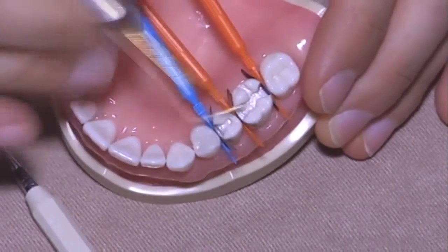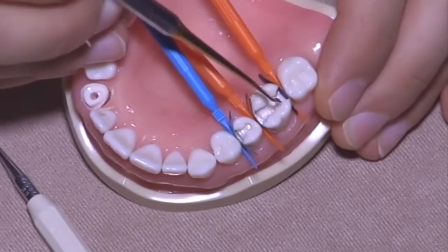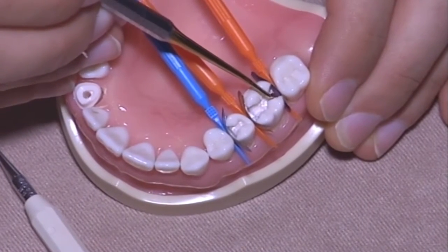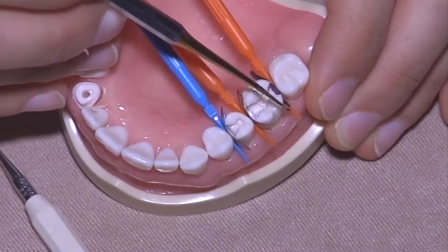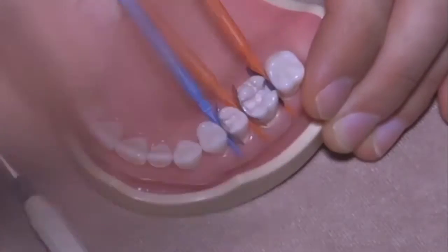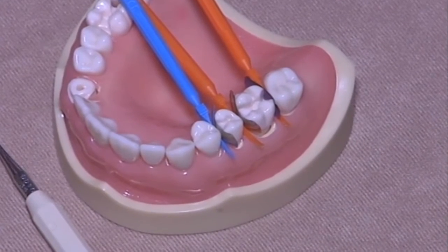So down there. Once you place the matrix and the wedge, before placing the ring, you just have to check that you do not have space here in between the cervical ridge of the cavity and the interproximal matrix. And then that your matrix must be stable. So if you touch it, it moves here, but it doesn't rotate and it doesn't move in vestibular or palatal directions. Once you have that, you can place the ring.